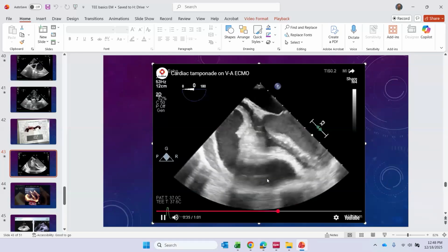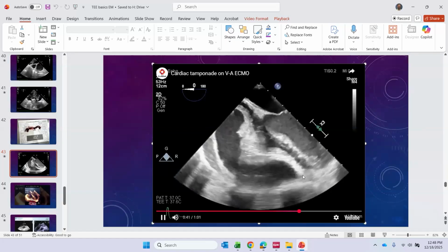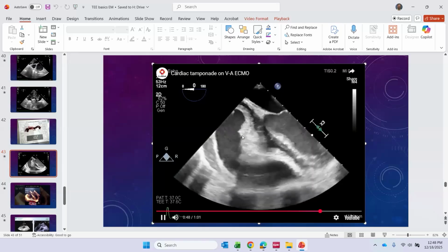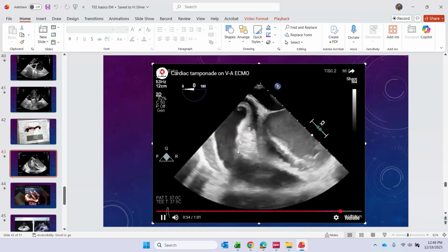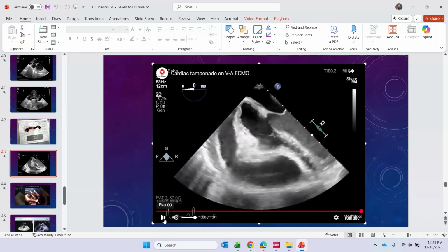This is something that I encounter sometimes with patients going to the electrophysiology lab who are getting a pacemaker lead, particularly if they're getting an atrial lead. The atrium is pretty thin-walled, it can tear, and now they get cardiac tamponade. Right. So tossing that probe in, you can help see this. You can say, all right, you need to drain this tamponade. We need to either do it percutaneously or do a window.